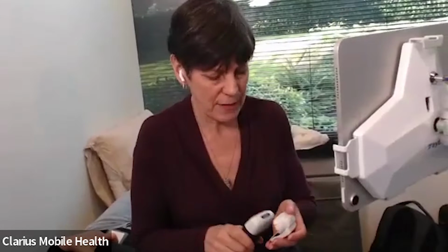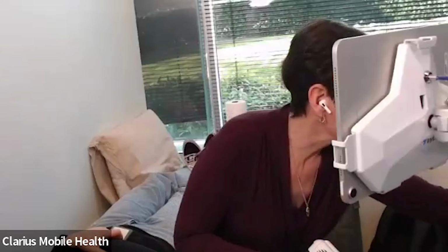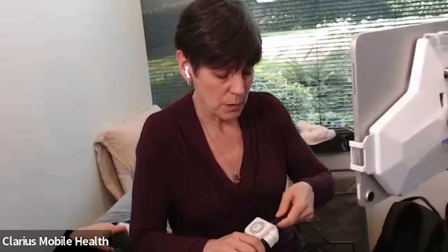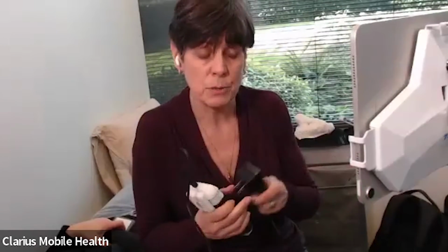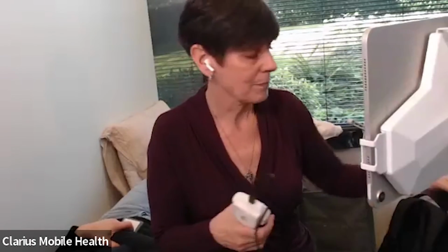Great. Power fan. Now, if you find yourself in extended use scenarios or an educational situation where you're scanning for a long time, you can simply pop the fan on for extra cooling. The other nice thing is you can attach the USB cord to the top of the fan to connect to an external power source. You can plug it into the wall, or you can use an external power pack, and that gives you limitless scanning time.